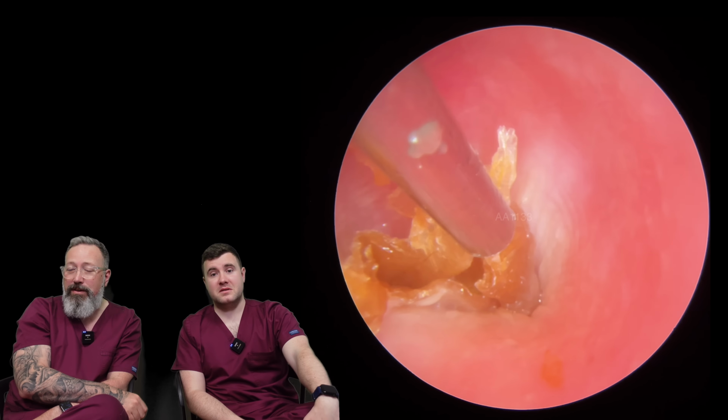But it's starting to peel now from the top. I'm trying to lift from the bottom to peel the bit on the other side of the recess. And I'm trying to peel from the top. I'm just looking for any way we can get an angle. And this bit is giving me some promising movement. But you can see I'm just hanging on to it as much as we can with the fine ends.